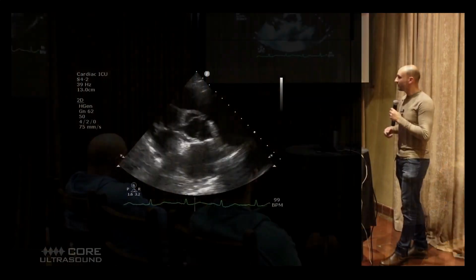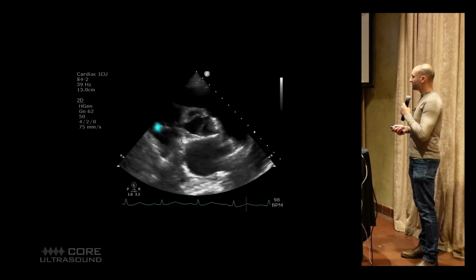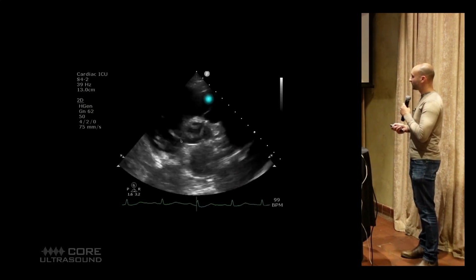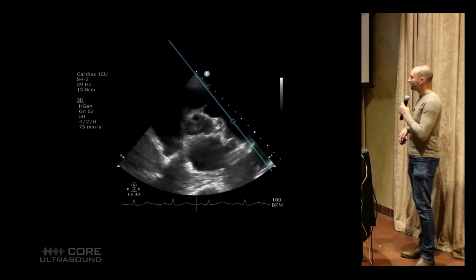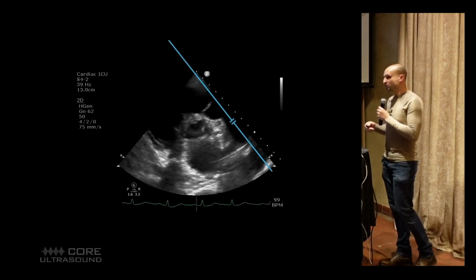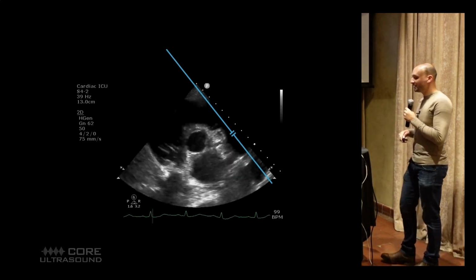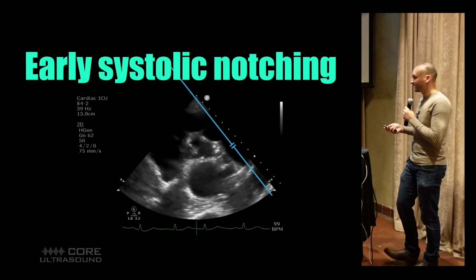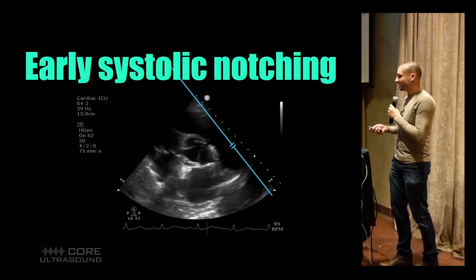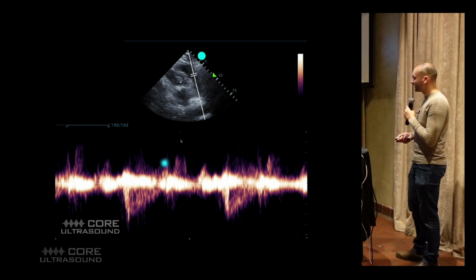So what you do is you get this high parasternal view where you can see the tricuspid valve, you can see the pulmonic valve, and you're focusing obviously on this area right here. You place your pulse wave Doppler gate just on the outside, or distal, to that pulmonic valve, and you're looking for something called early systolic notching. It's pretty sweet. I've actually seen this on acute PE patients a few times. In a normal patient, it should look like this, a relatively quick spike up with an easy downgrade, a kind of shark fin looking thing.